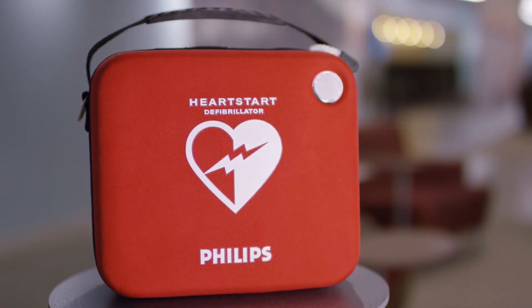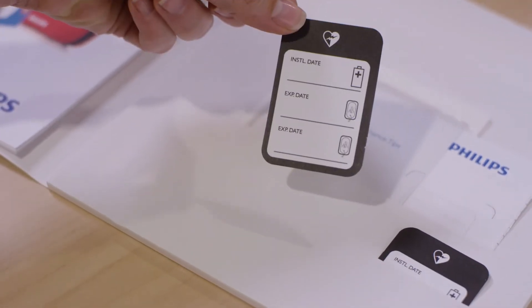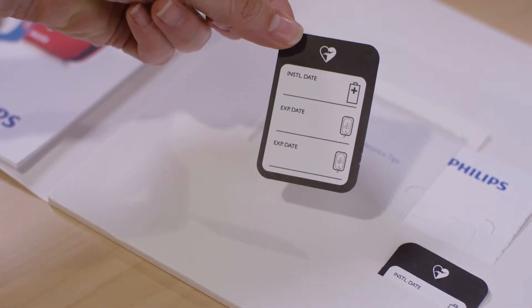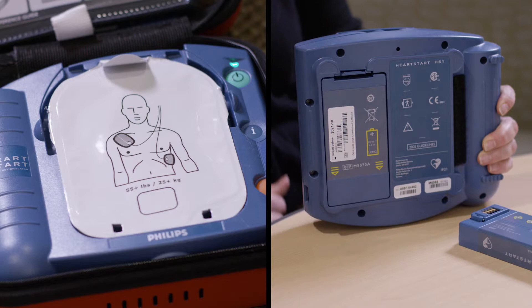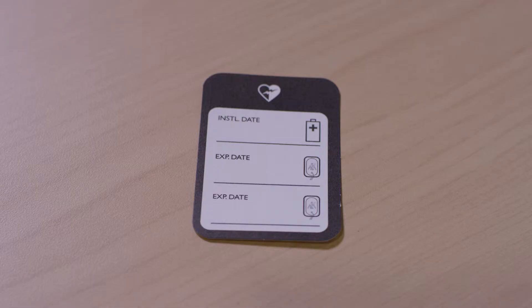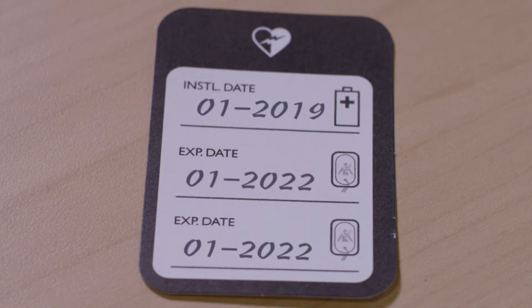Maintaining a Philips OnSite AED is pretty easy too. Each system comes with a simple maintenance sticker to keep track of the two accessories — the pads and the battery — that will eventually need to be replaced. On this sticker, write down the key dates for your accessories: the install-by date for your spare battery and the expiration date for the pads.